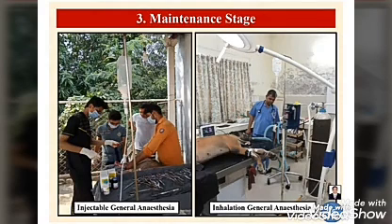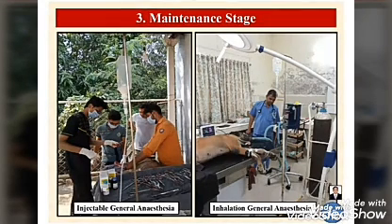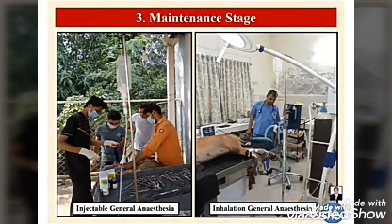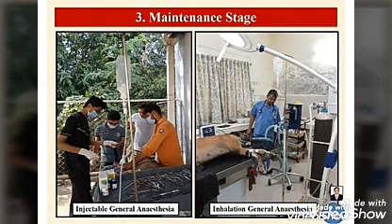Halothane is now outdated in India. Now India has shifted to isoflurane, and the world has shifted to sevoflurane and desflurane. Isoflurane is new for India, but some institutes also use sevoflurane. But halothane is now outdated. So those who are interested in purchasing an inhalation anesthesia machine, don't purchase a halothane-containing inhalation anesthetic machine. Purchase an isoflurane-based inhalation anesthetic machine.